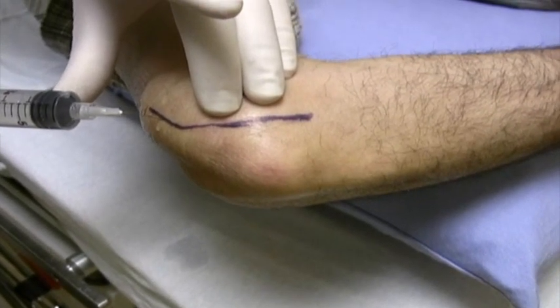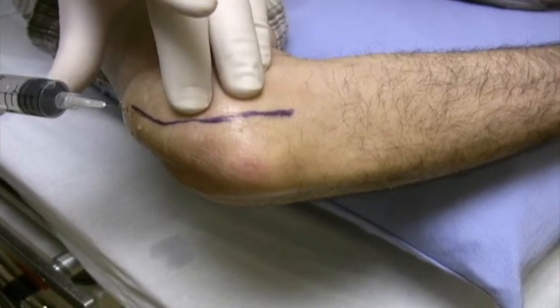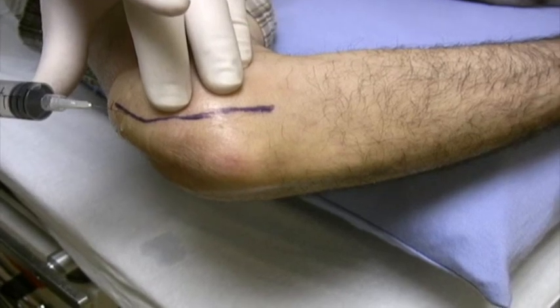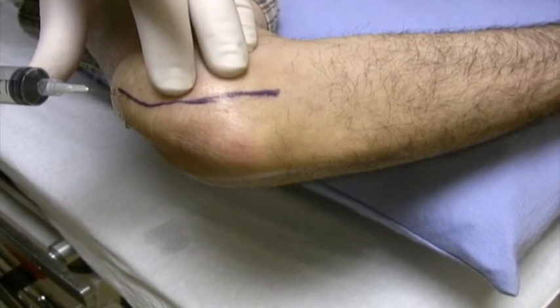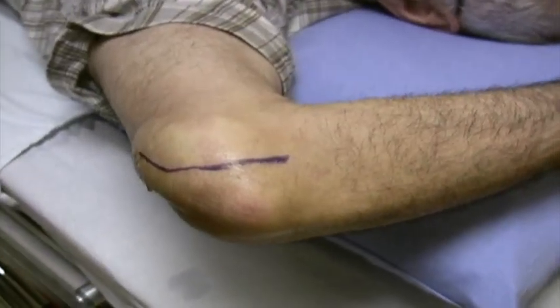The only time I would transpose an ulnar nerve now is with active movement after we release the nerve. If the nerve was subluxating out of the cubital tunnel, in that circumstance, I would go ahead and transpose it. I just tack a suture, do a subcutaneous transposition.